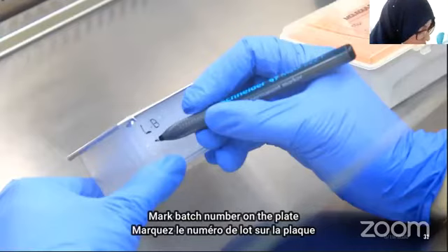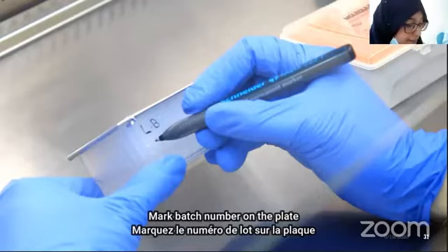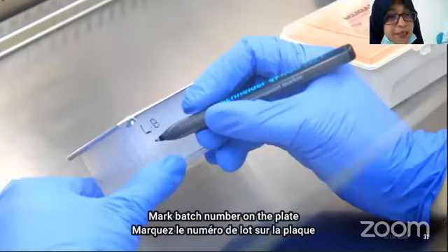How to mention sample ID on the plate. On the plate, we mention the batch number, the total number of samples, the date, and the district. But we do not mention the sample number. We have the template outside our safety cabinet, and we paste the template on the safety cabinet. We only mention the batch number, and we know how many samples this batch contains.